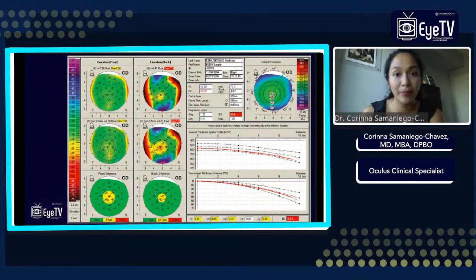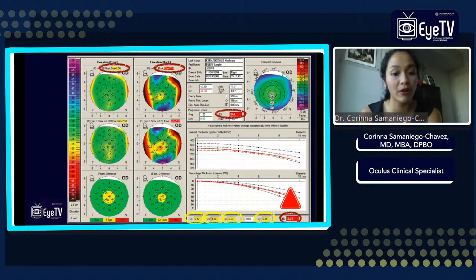This cornea has a number of variables that fall in the suspicious area. Both the anterior and posterior elevations show small central yellow zones, and the pachymetric progression and thinnest point displacement are also in the yellow zone. Only the thinnest value at 568 micrometers is normal. The combination of these suspicious values, however, is enough to put the overall reading well outside the normal range and is therefore displayed in red. Additionally, this display warns the user that there is insufficient corneal coverage and the user should attempt a repeat image which would give the full 8 millimeters of analyzable data.